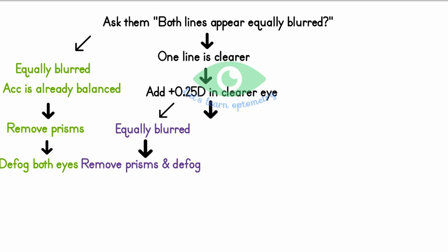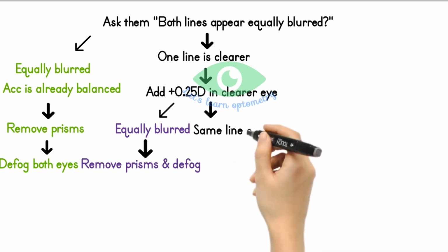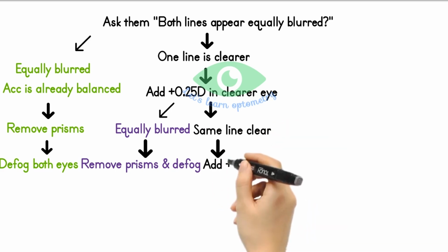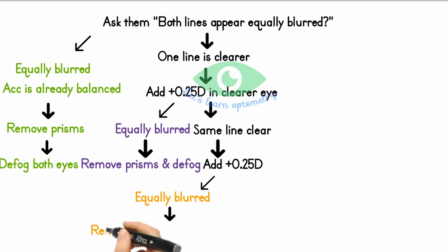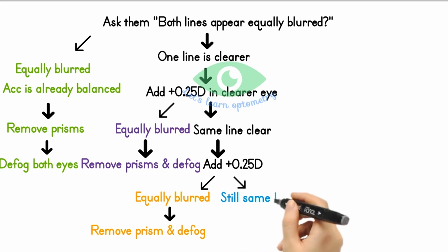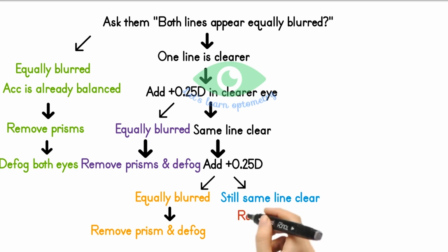If the patient says the top image is still more clear than the bottom one, add additional 0.25 in front of the right eye. Now, if they say both images are equally blurred, the accommodation is balanced. Now ask them to close the eyes, remove the prisms and then ask them to open their eyes and defog until you achieve their initial BCVA. If they say the top image is still clear, recheck refraction and make sure the patient understood the test, because more than 0.5 diopter of balance may be caused from wrong refraction and may not be due to accommodation.